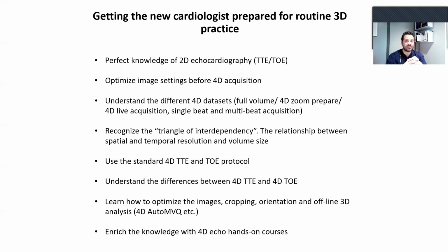We have to use standard 4D transthoracic and transesophageal protocols, understand the differences between transthoracic and transesophageal echo, learn how to optimize our images, how to crop, how to orient, and how to do offline analysis, and of course enrich our knowledge with 4D echo hands-on courses.